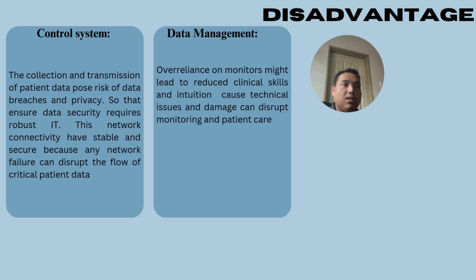For the second, data management. Overreliance on monitors might lead to reduced clinical skill and intuition. Technical issues and damage can disrupt monitoring and patient care. Okay, the other slide can show how a patient monitor works.